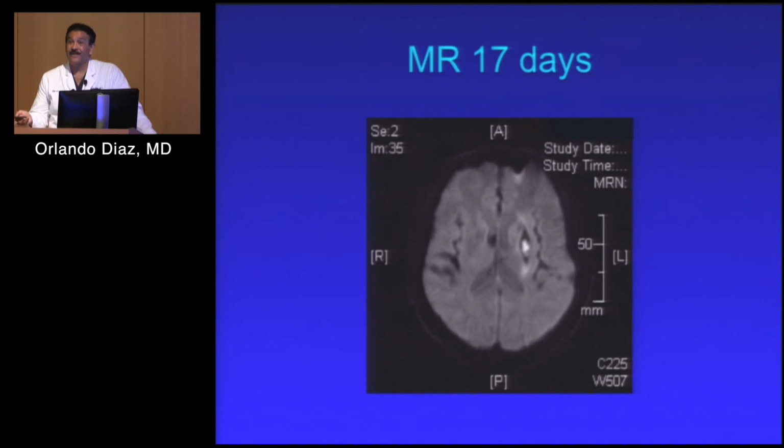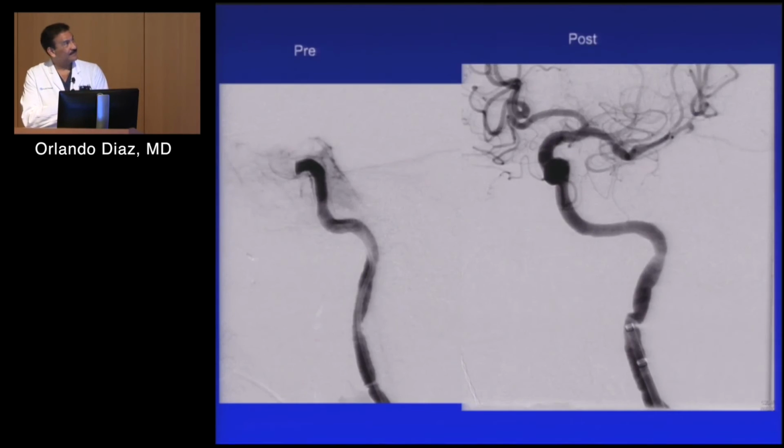Depends. If there was no penumbra, it's going to be a large stroke because it was too late to come here. Sometimes we don't know when was the start of the ictus. Sometimes the patient wakes up with the stroke and it was more than 6 hours, and we don't know. But we try to open. Sometimes this patient develops a small infarct. Look at that. This is internal carotid. Mortality of this one, if we don't do anything, is 50%. Mortality for M1 is 30%.